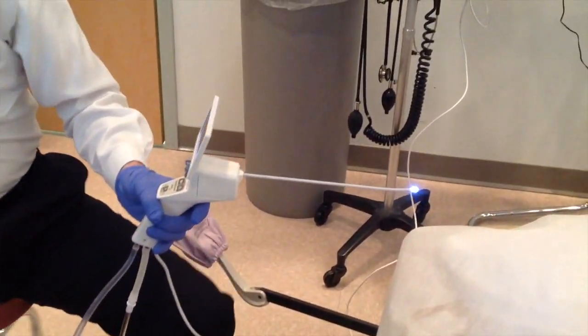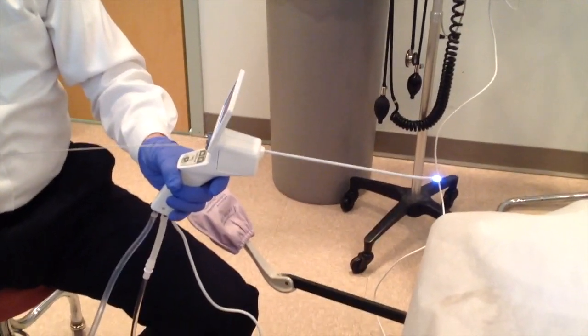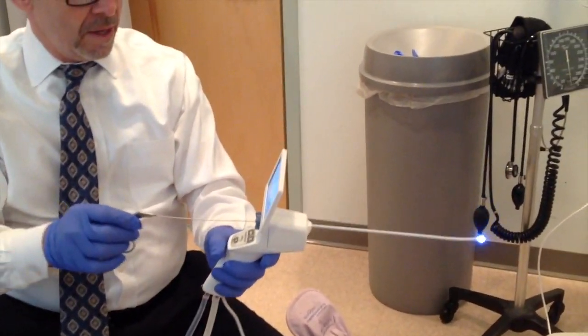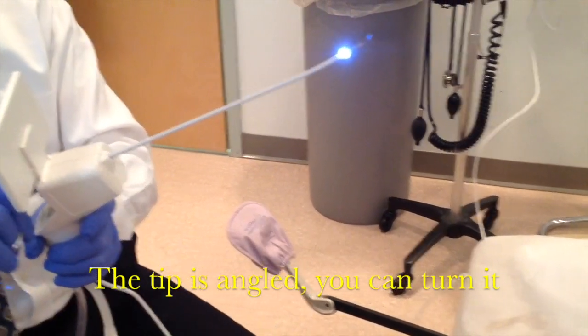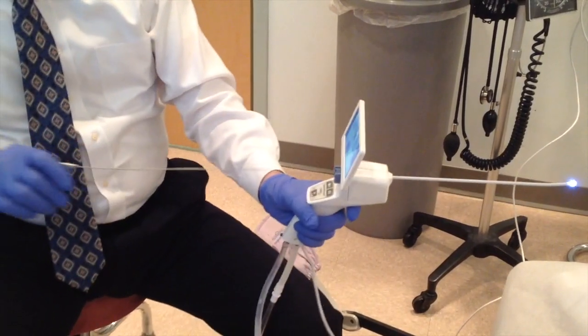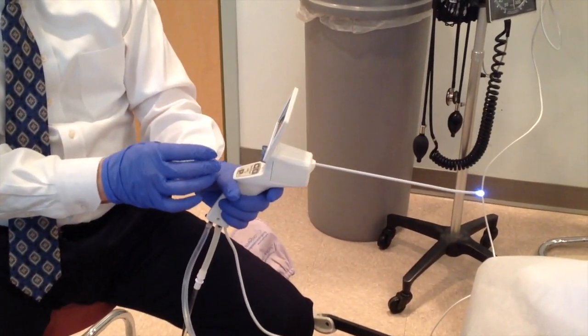So then you're doing your hysteroscope — going up inside the cervix. We did an embedded IUD, so you basically slide the grasper down, and it comes out the other end. And there it is. You can do that with the water flowing, and now you take it out. You can use the scissors down through there as well.